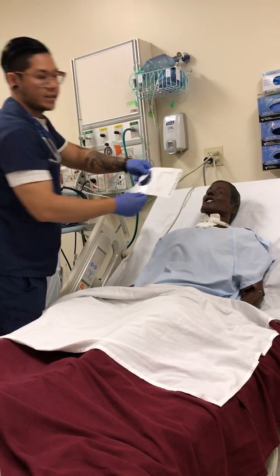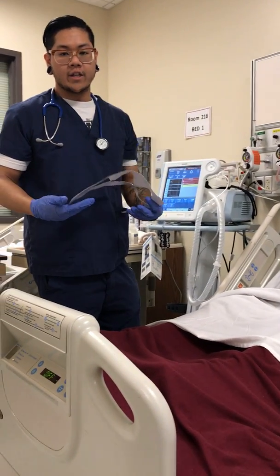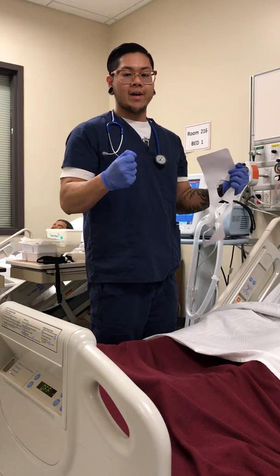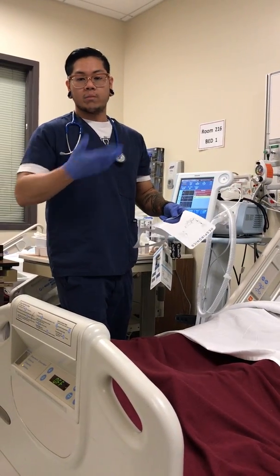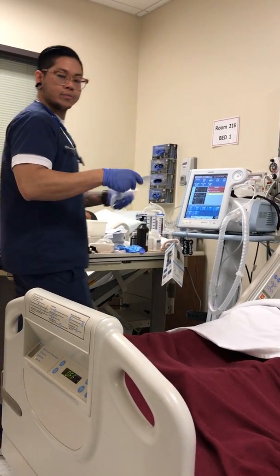And you want to find the mask that is the smallest that can fit comfortably for the patient, because you don't want any leaks, and you also don't want it to be too tight. When you do put the mask on, you don't want to over tighten it, because it can cause tissue necrosis, which is like bleeding, bruises. It can just rip apart. It's not good.